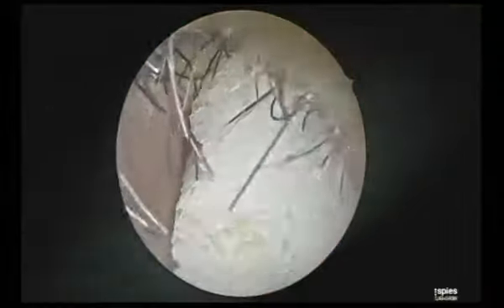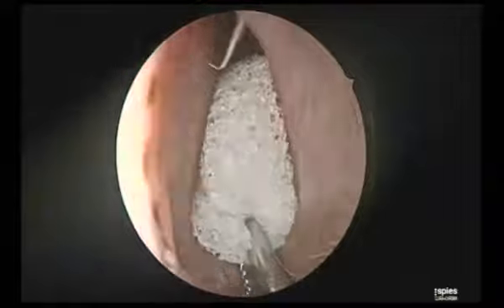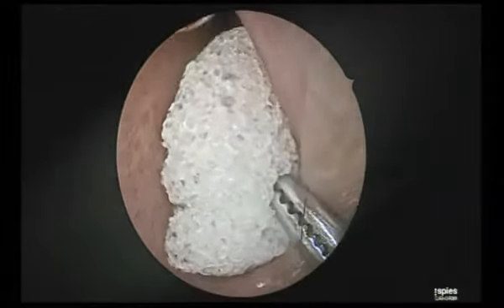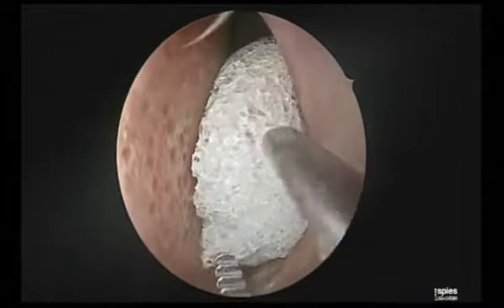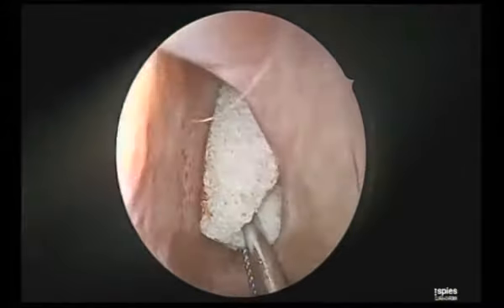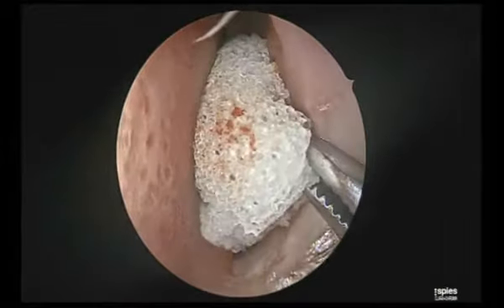Yes, Ashish. Now, as far as the instrumentation you mentioned, for the junior colleagues I would like to mention one thing here. I'm working in the left nasal cavity. See my instrument here. My endoscope and instrument are converging, so they don't cross each other. If I'm working on the left side, see how I'm stabilizing my hand. I'm pressing on the columella with the telescope.